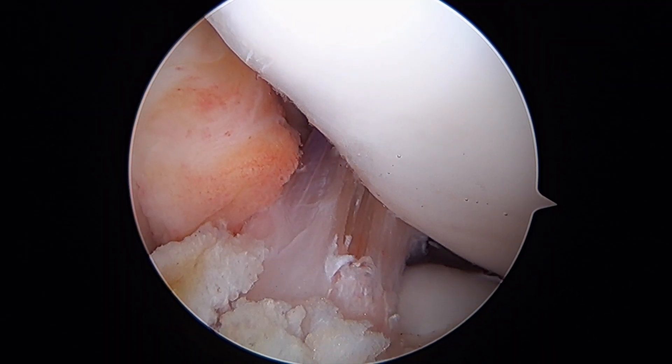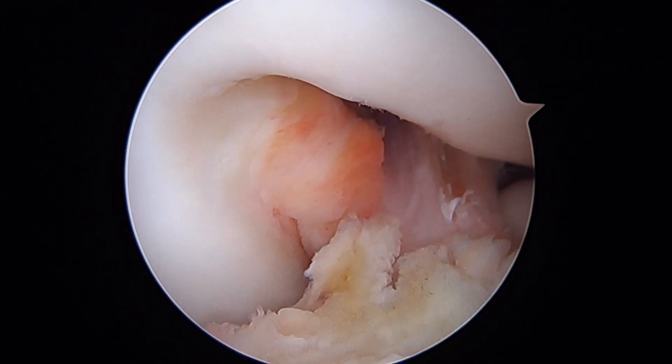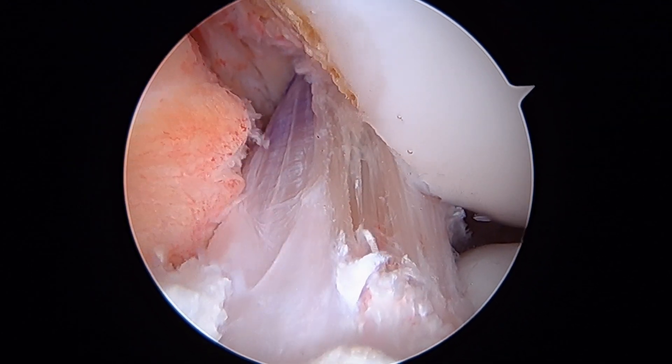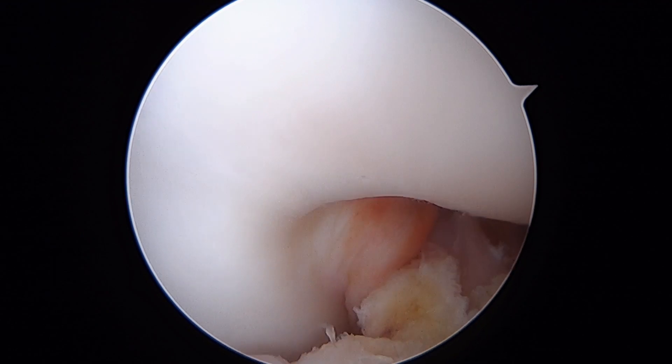Just look at our finished final product here. That's a BTB autograft ACL reconstruction. Looking down into the notch, there's the reconstructed ACL — leg is in full extension.